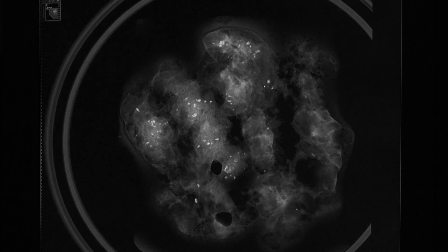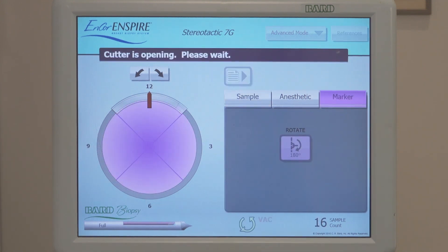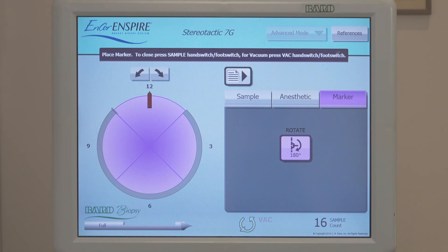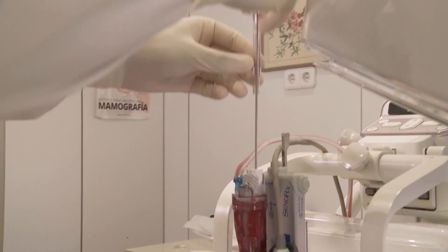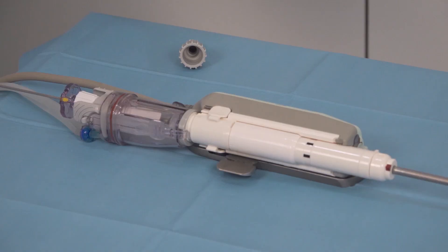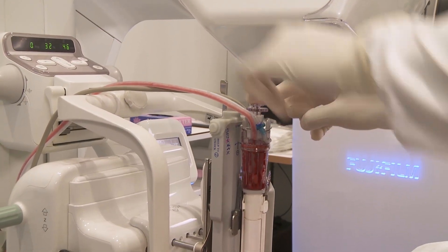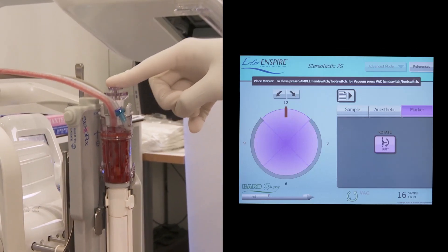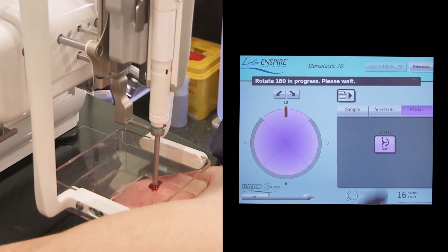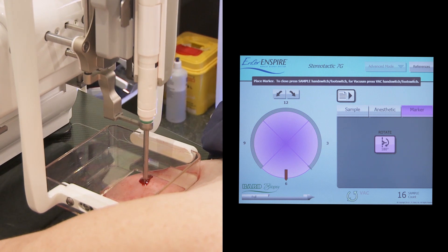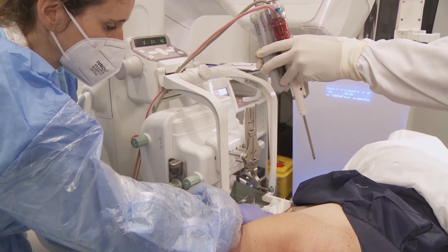The use of a tissue marker is recommended to locate the site of the biopsy for follow-up imaging. Select the marker tab. Replace basket rear cover with the marker adapter and introduce the marker applicator through the probe internal sheath. Make sure the applicator yellow marker aligns with the red probe marker. Push the applicator firmly all the way to release and deploy the tissue marker in place. Touch the rotate button on the screen. The notch will rotate 180 degrees to avoid pinching the tissue marker. To minimize migration, both the probe and tissue marker applicator are removed from the breast as one unit.